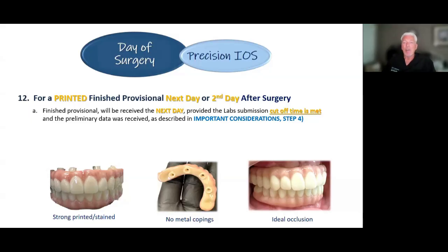Now, labs are going to have a cutoff time on the day of surgery for them to either provide you with a design the same day so that you can print it in your office, stain and glaze it, and deliver it to the patient the same day, or they can print it at the laboratory, stain and glaze it, and get it in FedEx, overnight it, and it arrives the next morning to whoever wants to seat the provisional the next day for the patient.